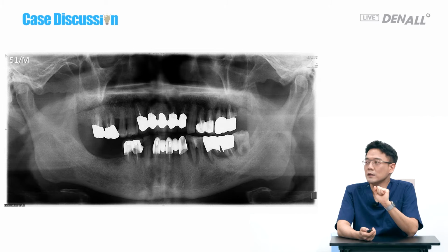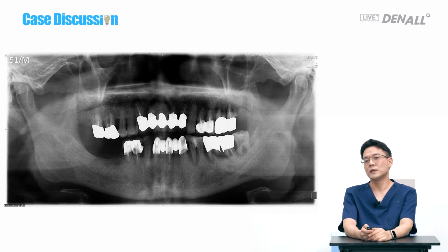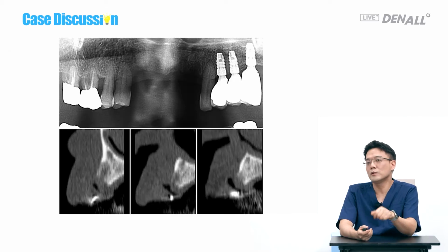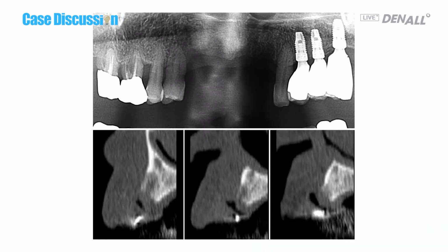I would like to share a very challenging anterior case of mine. The patient came to me in his 40s 10 years ago. Anteriors were mobile, so they were extracted, and implants were placed in other areas as well. Because of the periodontitis, the bone is seriously resorbed in the anterior region.